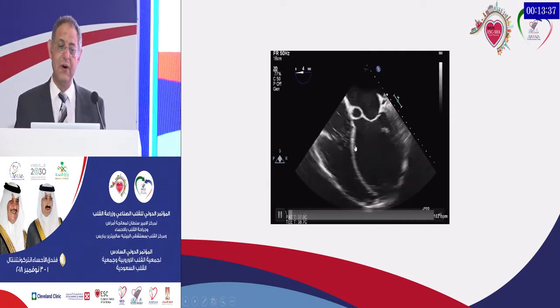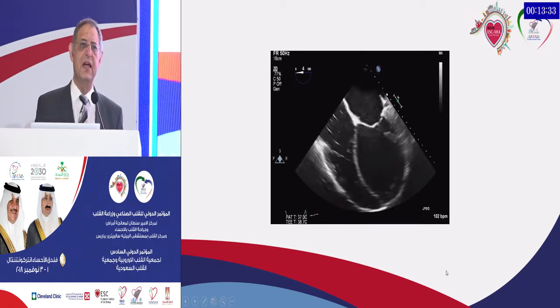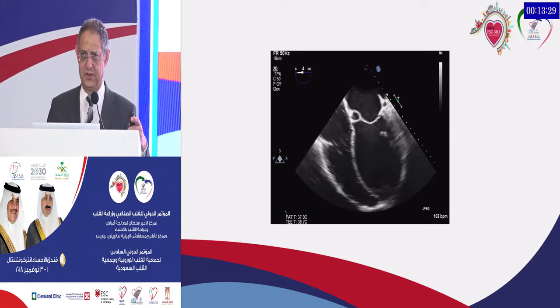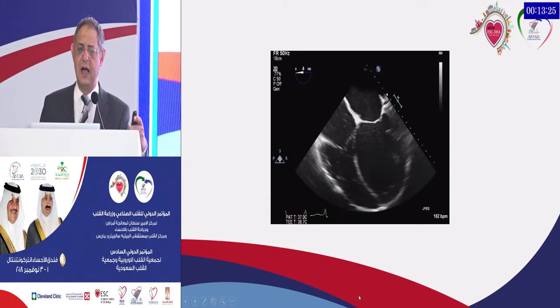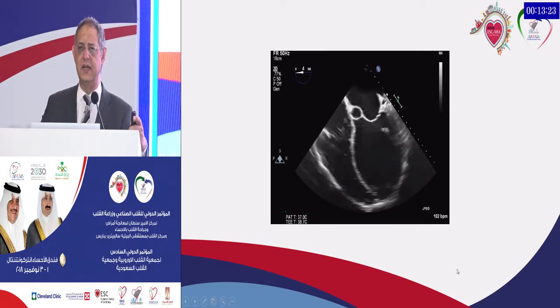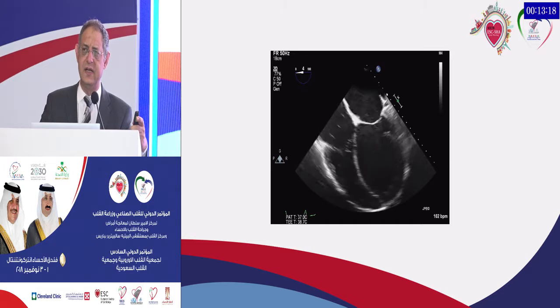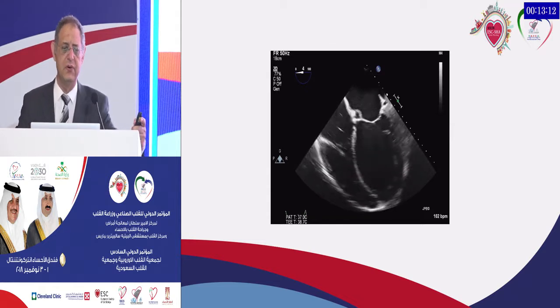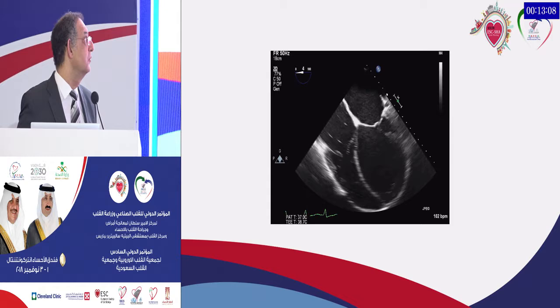But what about the RV? We don't yet have solid criteria to evaluate the RV function. We started to face this problem after the introduction of the LVAD program in our center, and every time the surgeon asks us what the RV function is, because it is one of the most important determinant factors for prognosis.